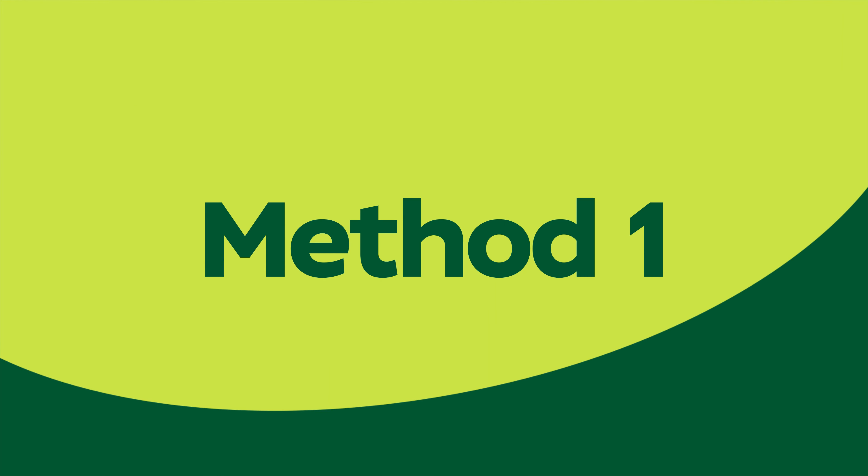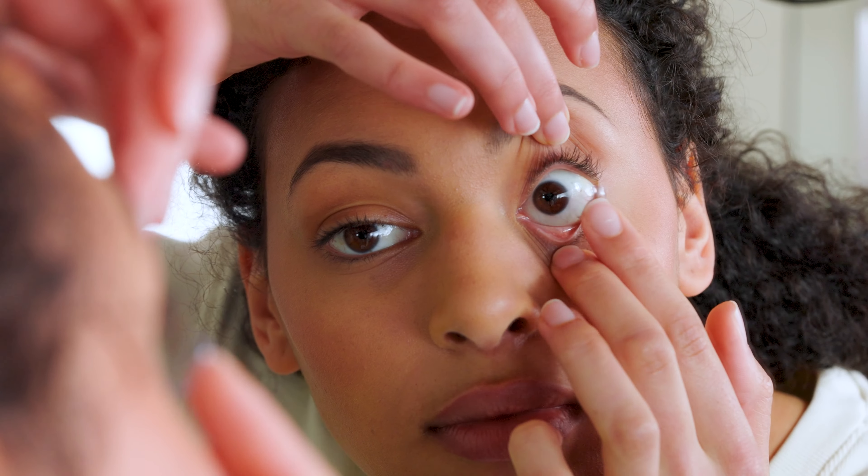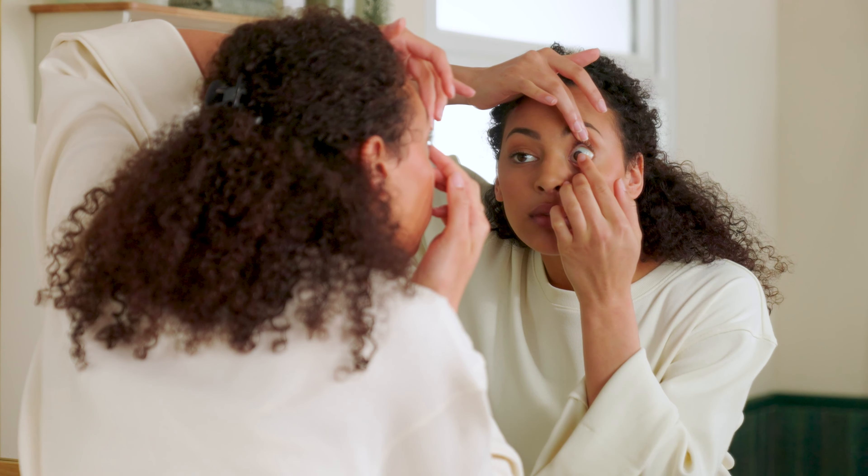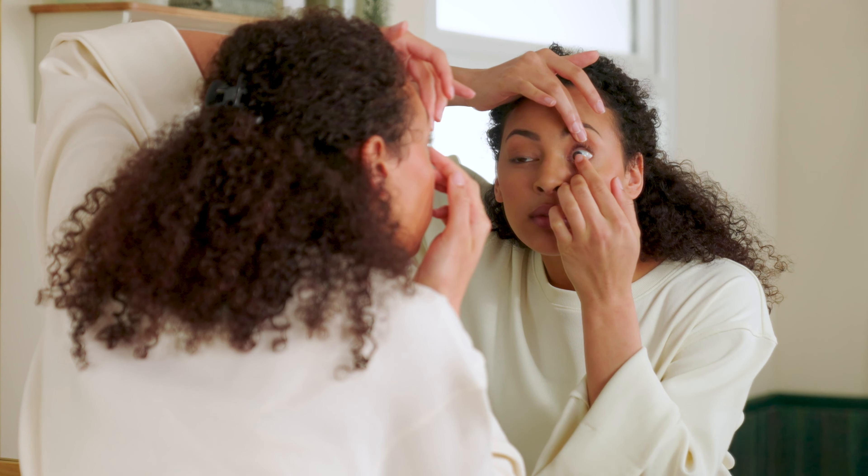Method 1. Place the lens on the tip of your index finger. And with your other hand, pull the top eyelid up, holding as close to the lash line and centrally as you can. With your middle finger on the hand which you're ready to put your lens in with, pull your bottom eyelid down and slowly bring the lens towards the center of your eye. Once you feel the lens is in, close your eyes and move them from side to side. This gets rid of any air bubbles. Then simply repeat on the other eye.